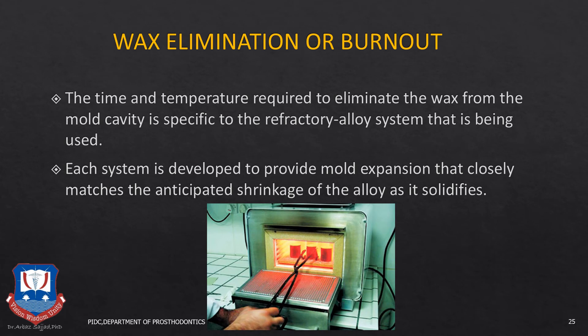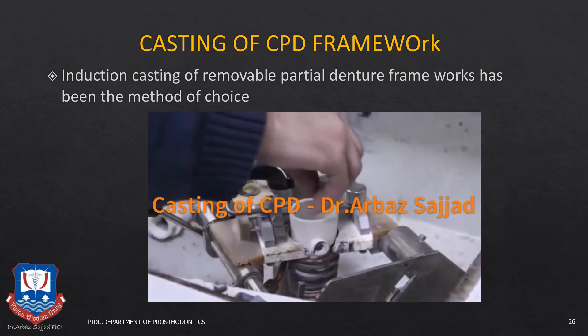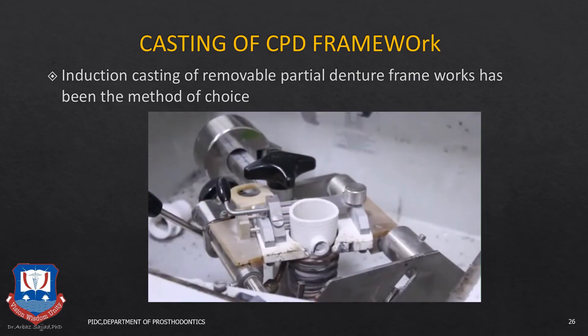After investing, the wax elimination is carried out because the entire wax sprues, the CPD framework, and the reservoir wire are all made up of wax. First a burnout is done by placing the investment rings inside a burnout furnace. Once the burnout is done — that is, wax is eliminated from the mold — casting of the CPD framework can begin. For the past decade, induction casting has been the casting method of choice for all casting works. Induction casting is based on electric currents induced in the metal core from a magnetic field, using a heating coil of copper tubing.